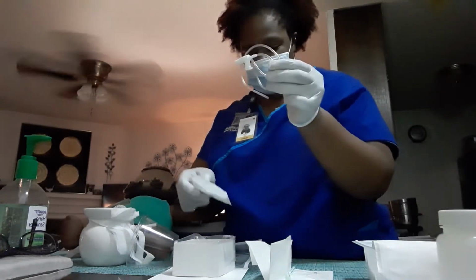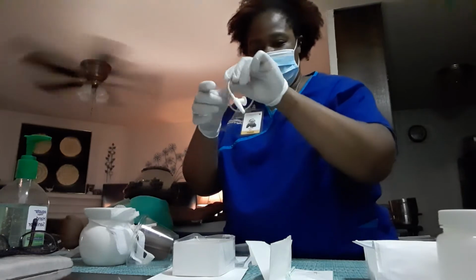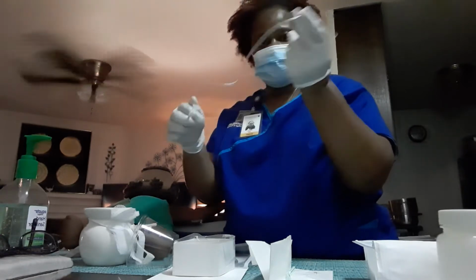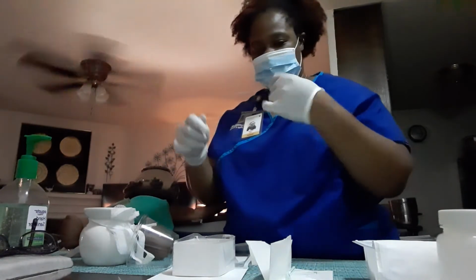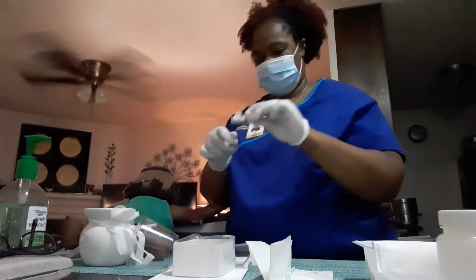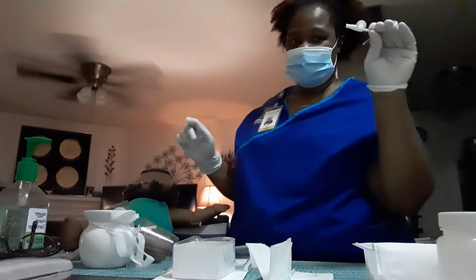I'm going to open my suction tubing up, and I'm going to curl my suction tubing up. Okay. I have my suction tubing in my sterile dominant hand.